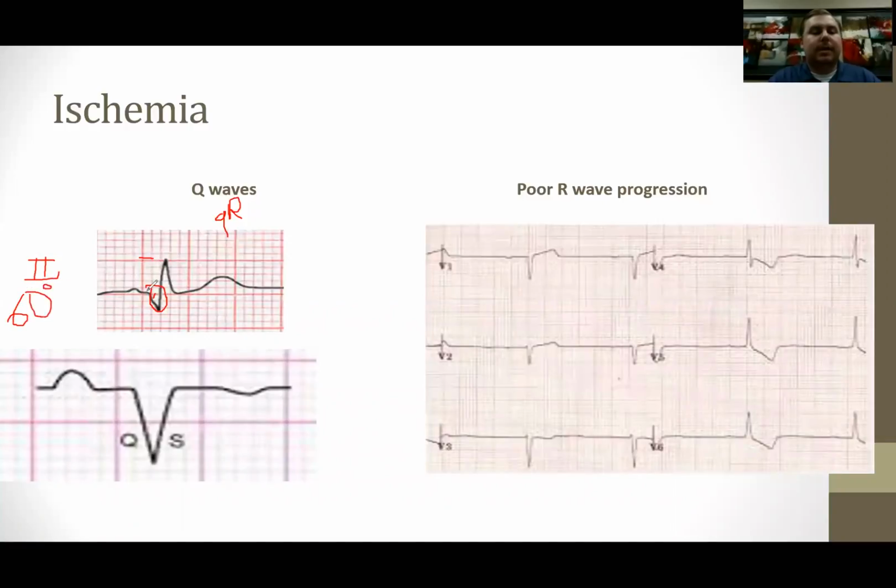Whenever the ventricle is depolarizing at the very beginning, what lead 2 is looking at isn't getting any electricity to it because part of lead 2 is dead. So it's not getting any discharge towards it. It's only getting discharge away from it at the very beginning of its depolarization. And then eventually it gets some conduction from some neighboring myocytes, and finally it gets an R wave. So part of lead 2 is still alive, but part of it is definitely dead.